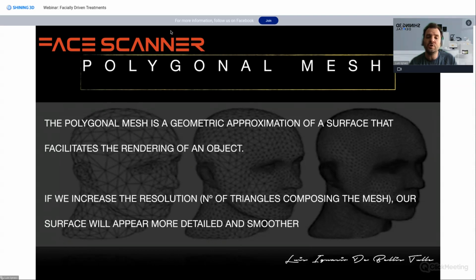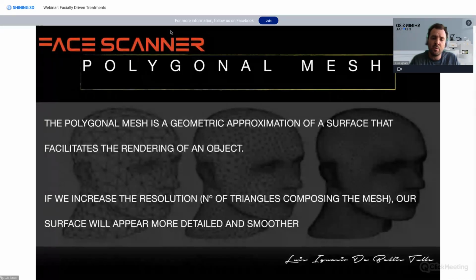You are all going to get that polygonal mesh. But that polygonal mesh is going to be extremely different in different cases due to the devices that we are going to use. And when we're working in our CAD software, we will pay that cost. If we have a low poly resolution, it's going to be a mess for us to work with.